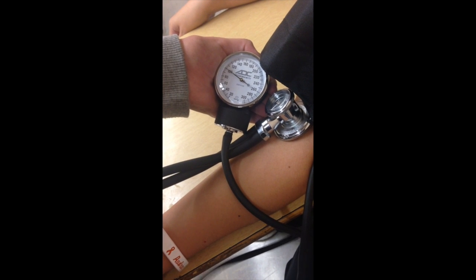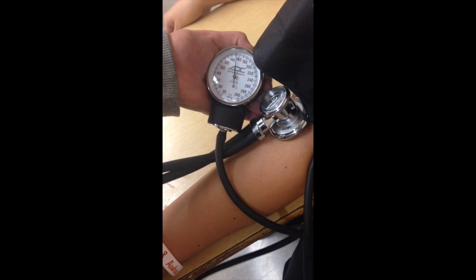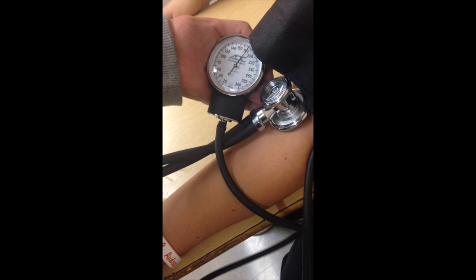It is important that you inflate the cuff to over 180 mmHg. Once you reach 180, slowly start to release the pressure at about 2-5 mmHg per second.